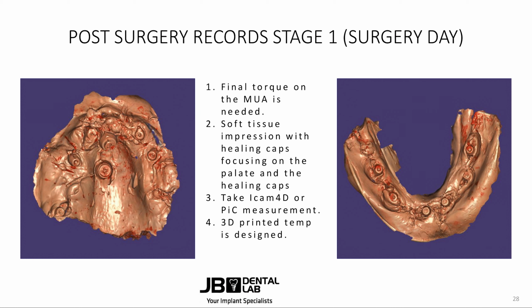Here are two examples of scans of impressions post-op with healing caps in place. Please note on the left-hand side, you can see the markers on the palate are still in place. Once you have these, send them to your designer and allow your designer a few minutes to make sure that the post-op soft tissue impressions match up with the pre-op scans with the breadcrumbs.